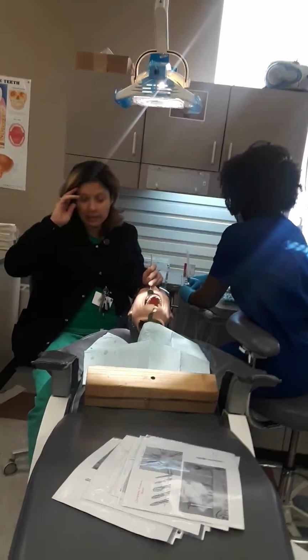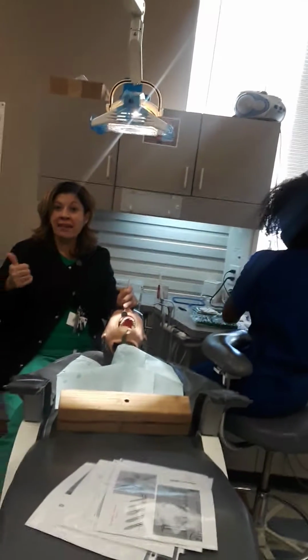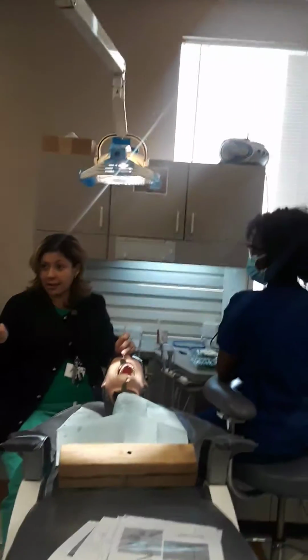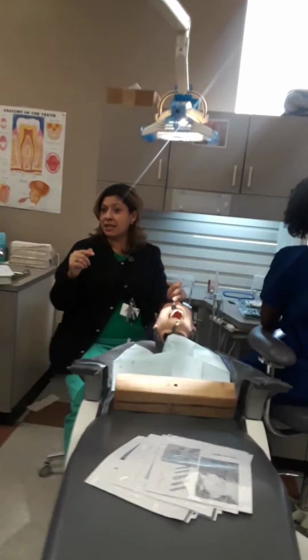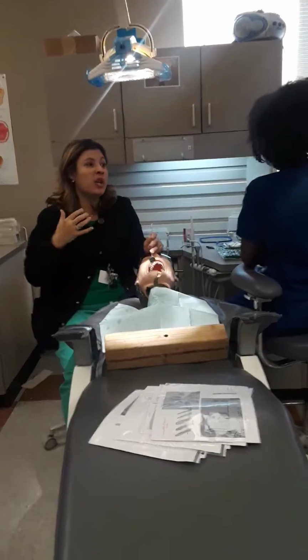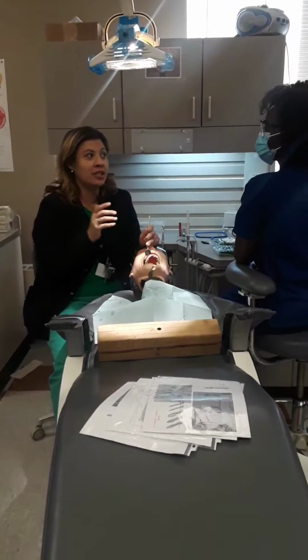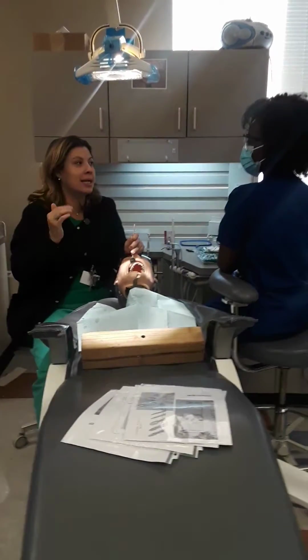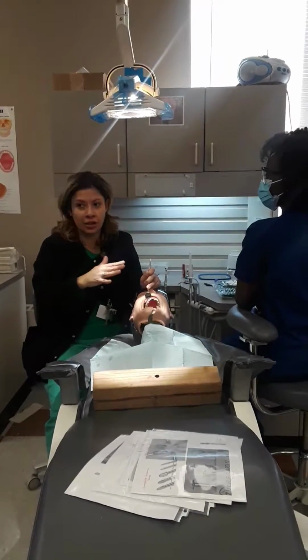Okay, so depending on your doc, if you want to do a side note, when you rinse, you have to rinse for the 10 seconds as well. And when you dry, maybe a dash of air instead of completely dry, because if you completely dry, we just desiccated the tooth. That's what it means. We desiccated it, which means we over dry, and we can harm the tooth again. So make sure you just kind of do a burst of air. That's it. If your doctor wants you to completely dry, let him tell you completely dry.